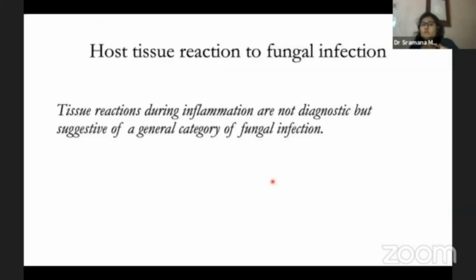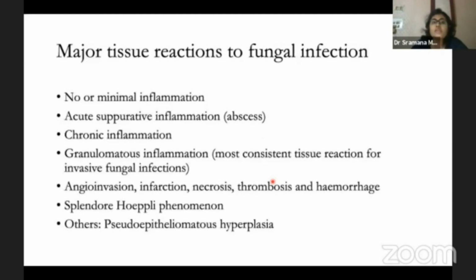When we talk about host tissue reaction to fungal infection, one has to remember that tissue reactions during inflammation are not diagnostic, but they can suggest the general category of fungal infection. So what are the major tissue reactions to fungal infection? I'll start with the fact that sometimes there will be no inflammation or minimal inflammation.